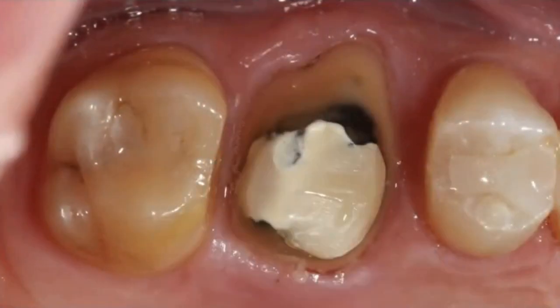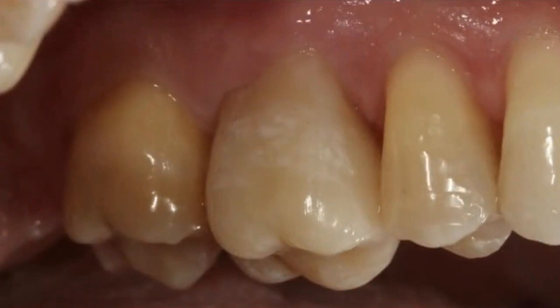So here's my prep. As you can see, there's no margin. You can seal this crown as close as possible to the CEJ, okay? When I do cement these restorations, I can even pack a cord, or I can pack Teflon tape if there's any bleeding. In this case, we dried the tooth very nicely, and we were able to bond this restoration. This is how it looks immediately after cementation. You can see the integrity of that soft tissue, how beautifully it seals. And this is just plastic, okay?